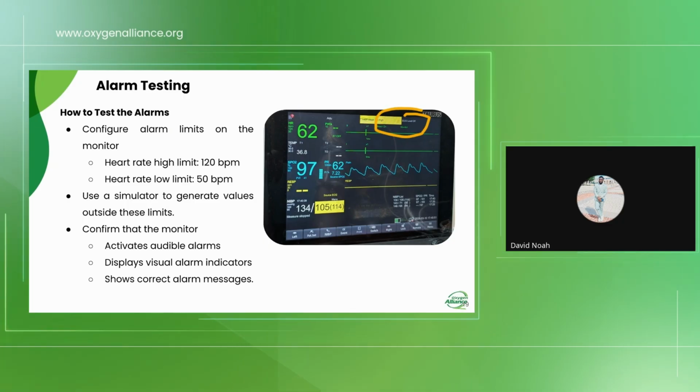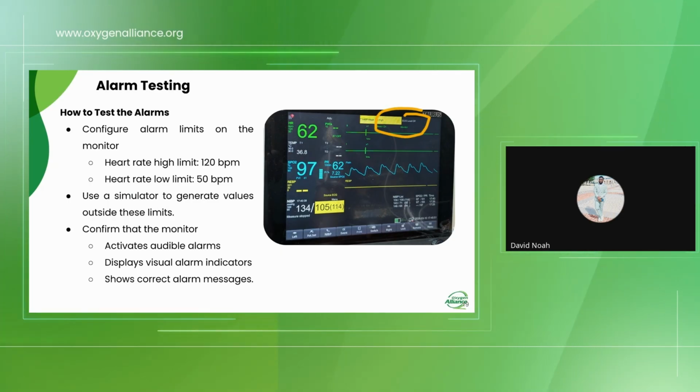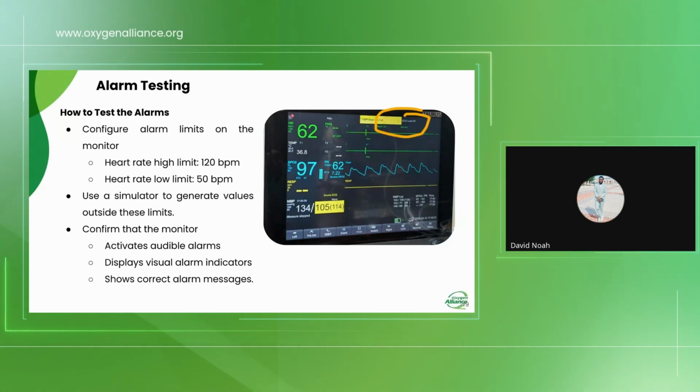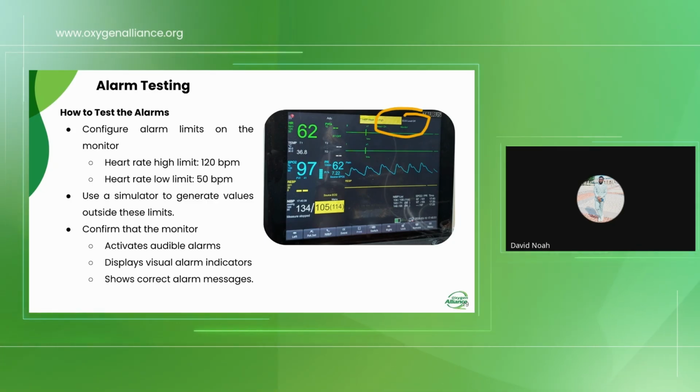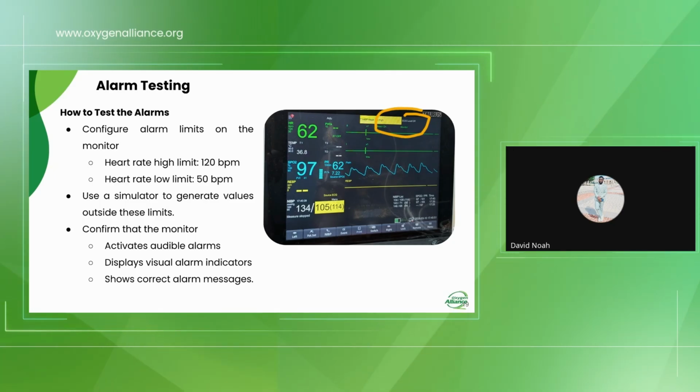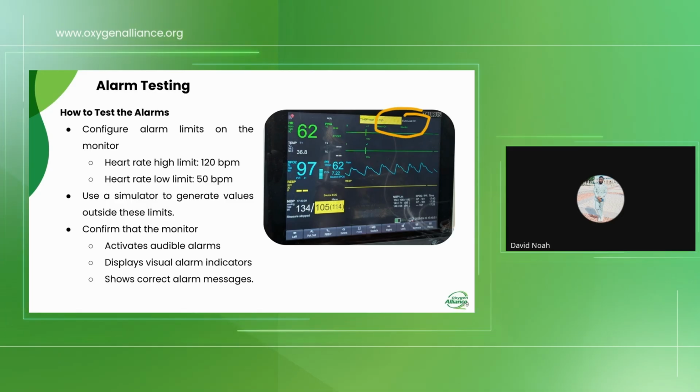For example, to test the alarms weekly or monthly, first of all you have to configure alarm limits on the monitor. For heart rate, you can set a maximum of 120 beats per minute and a minimum of 50 beats. Then you use the simulator to generate values outside these limits. For example, generate any value less than 50 and check if there is any audible alarm or any indicator on the alarm section that the heart rate is too low.